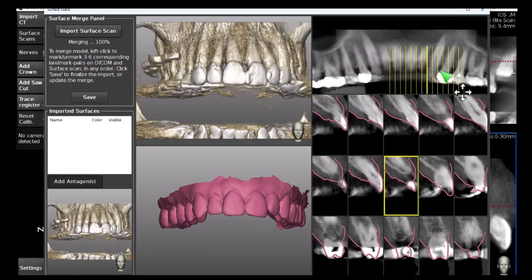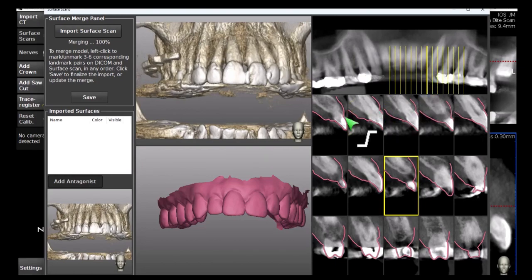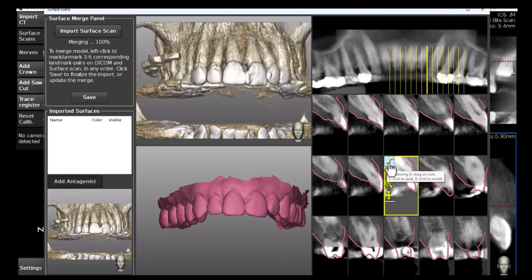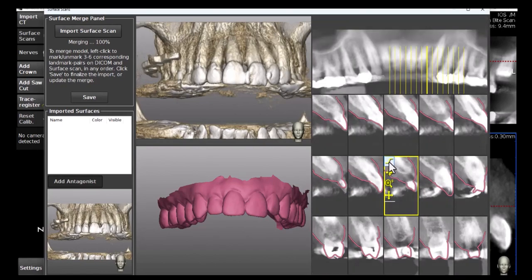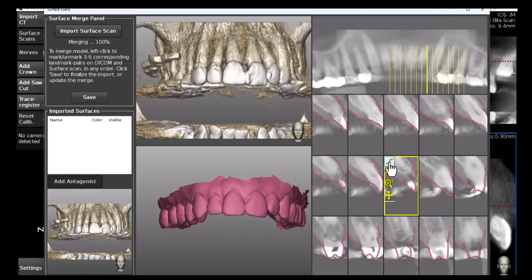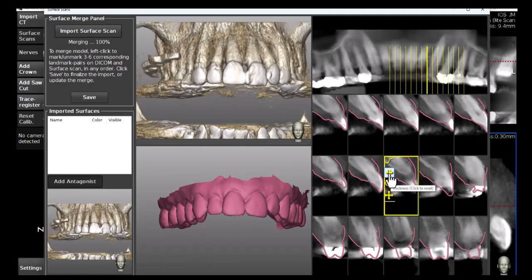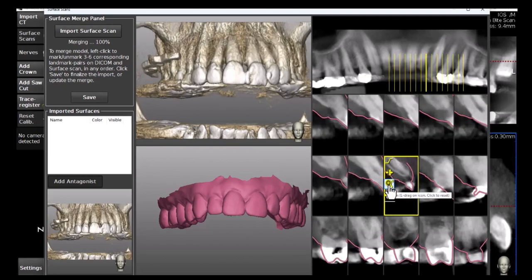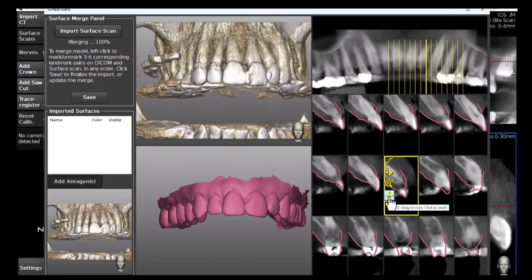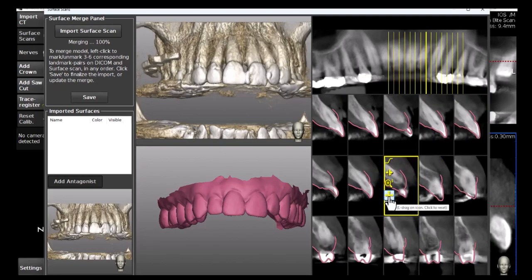As in the other viewports in Avident, each cross-sectional view has a pop-up toolbar that allows for the adjustment of the radiographic image brightness and contrast, the slab thickness, and zoom in or out and pan the image inside the viewport.